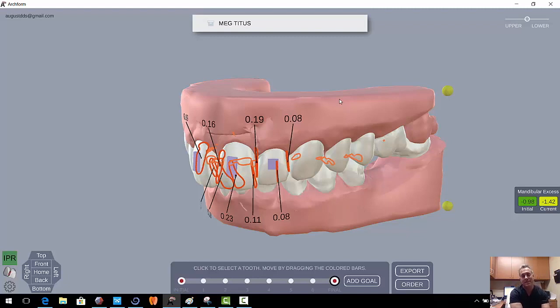The benefit of it, it's $50. The downfall is you need some experience with ortho to do this. There is not an orthodontist planning your case like Invisalign, Exceed Ortho, or iRock DDS. So use it with caution. Personally, I can see this in my practice in Class 1 crowded cases where we're only moving the front 8 teeth, so the front 4 on the top and the front 4 on the bottom. But let's go ahead and discuss the case and go through some of the steps here.